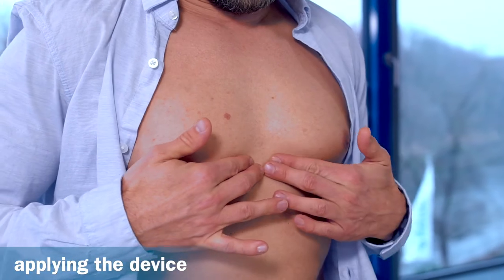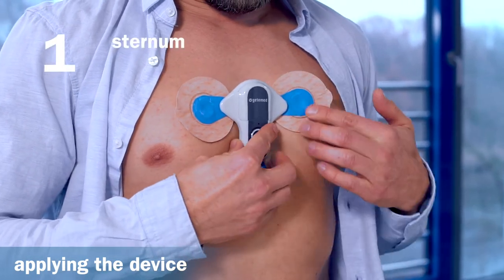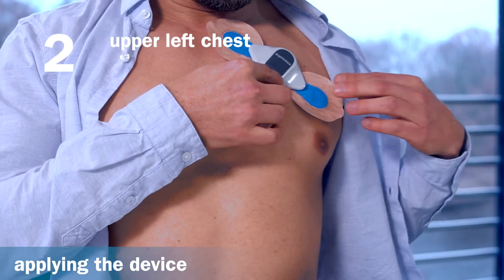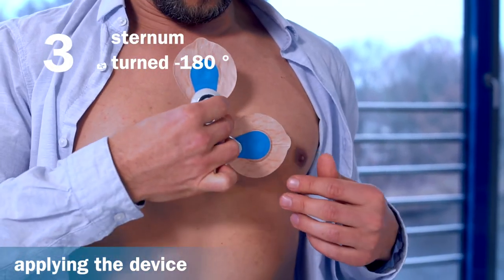The recorder can be worn in three ways: 1. On the sternum. 2. On the upper left chest. Or 3. Turned 180 degrees on the sternum.